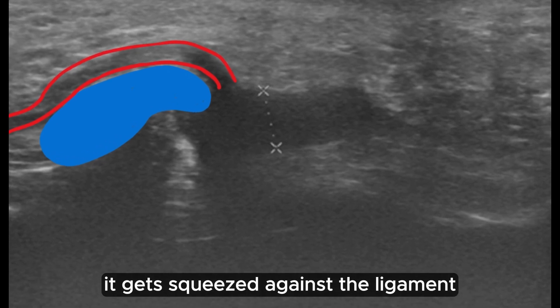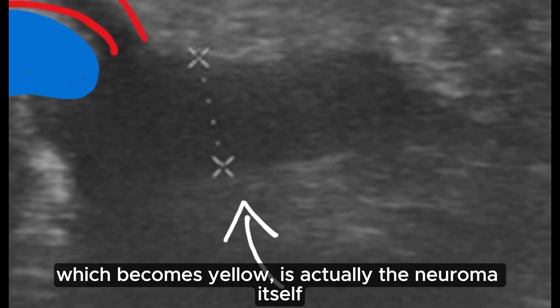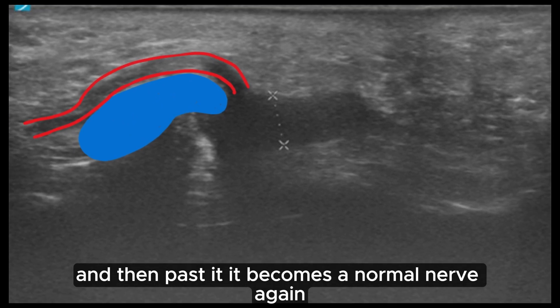The nerve gets squeezed against the ligament. And then the black area, which you can see now turning yellow, is actually the neuroma itself. And then past it, it becomes a normal nerve again.